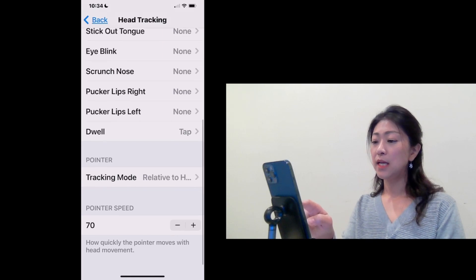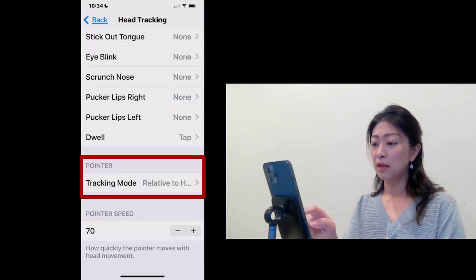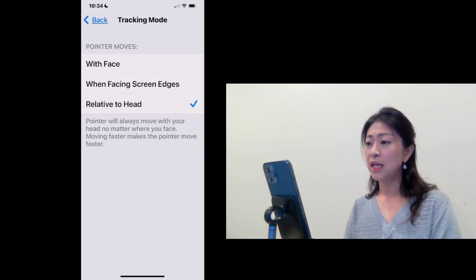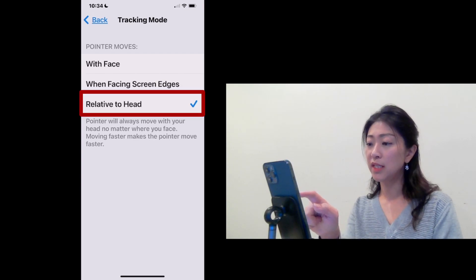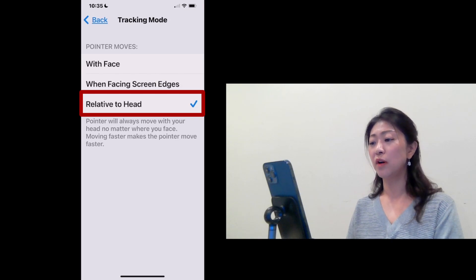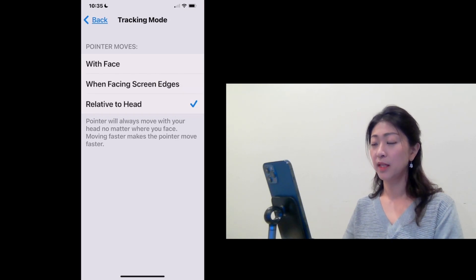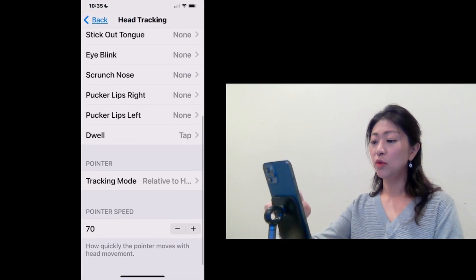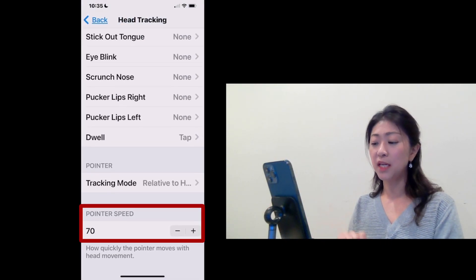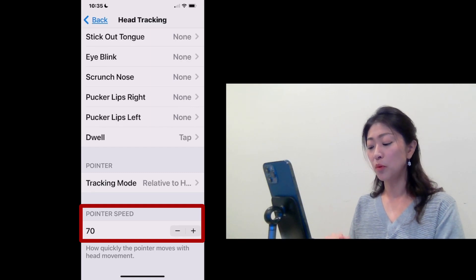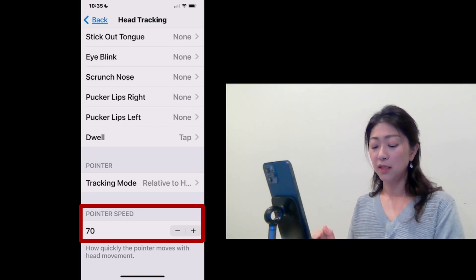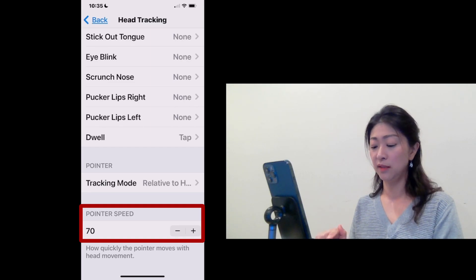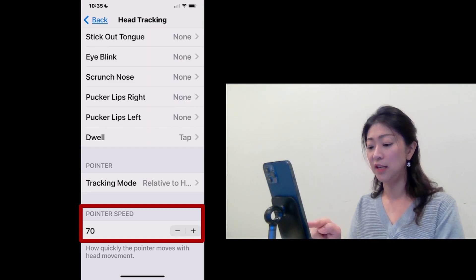And then for the Pointer, let's tap and see. Make sure Relative to Head is selected. Then go back. And then you can adjust the Pointer Speed. The Pointer Speed can be adjusted from 1 up to 100. This adjusts how quickly the Pointer moves with your head movement. I'll leave it at 70.